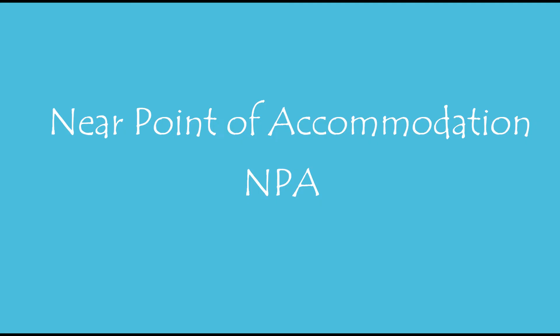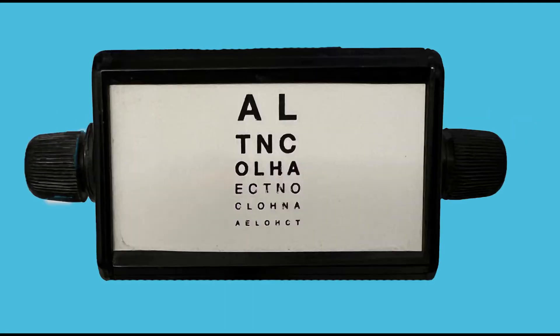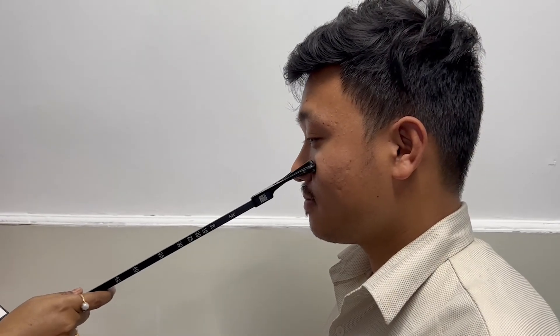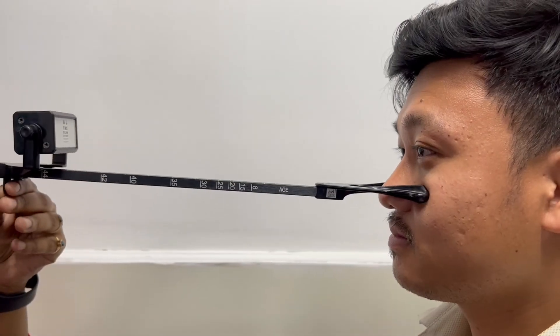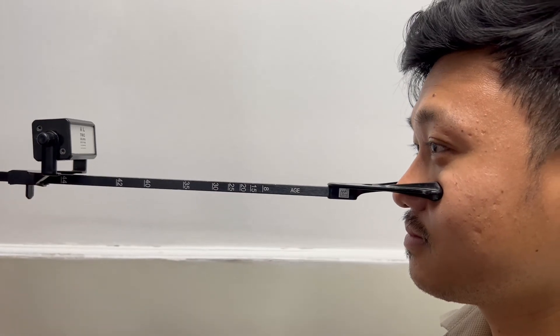To measure the near point of accommodation, the reduced Snellen chart is often used. The patient and the examiner should maintain the same eye level and the patient should sit straight in his position. The examiner holds the ruler and gently places the cheek rest of R.A.F. ruler on the inferior orbital margin and keeps the ruler straight.